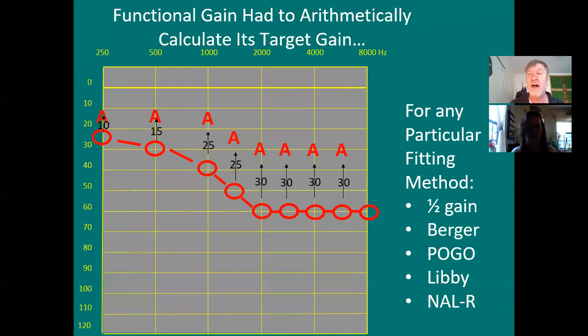This is still Unit 5 on early Real Ear. In this course we covered early fitting methods, and then today's fitting methods, and then early Real Ear and today's Real Ear. Always look at fitting methods as the predictor: this is what you hope to get. And always look at Real Ear as proving that you did get what the fitting method said you'd get. So one's predicting, fitting methods, the other is verifying, and that's done either by functional gain, insertion gain, or today's in situ output Real Ear.